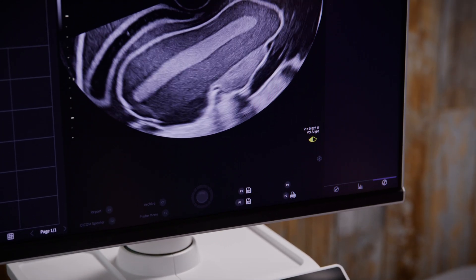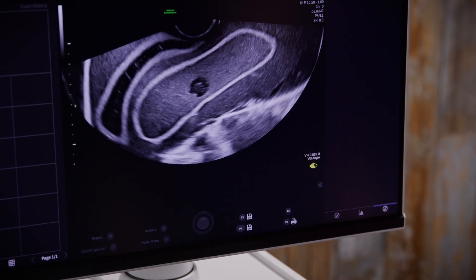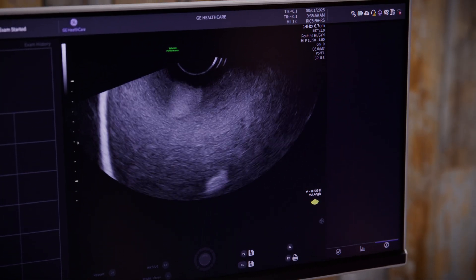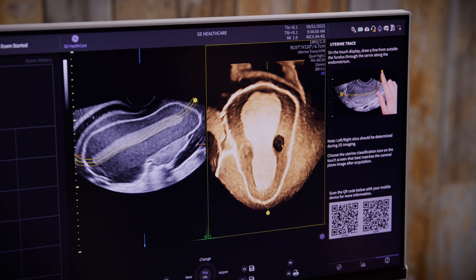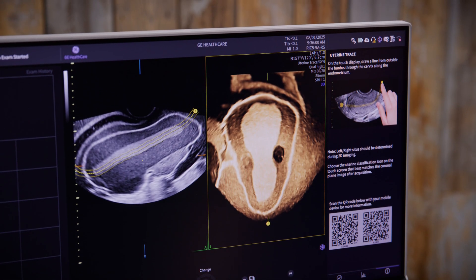Hold the probe still until the acquisition is complete. The system automatically acquires a 3D volume and displays the coronal view, which is critical for evaluating uterine anomalies like septate or bicornuate uteri, which are best visualized in the coronal plane.